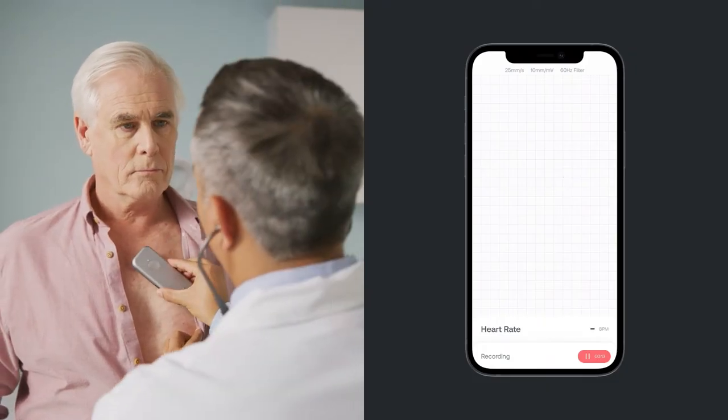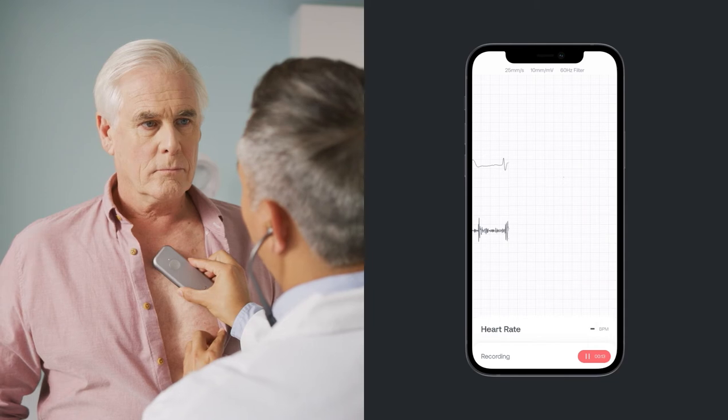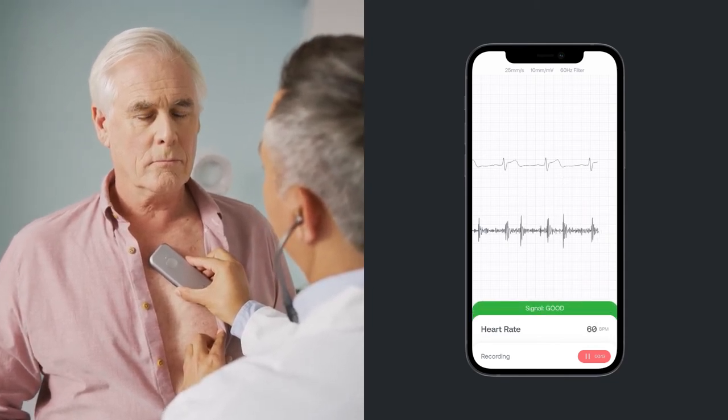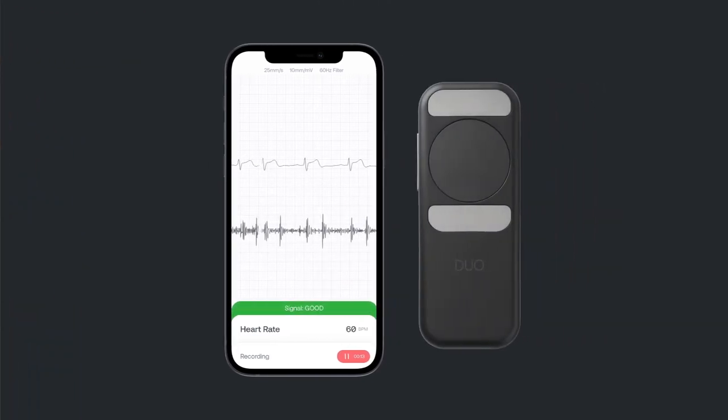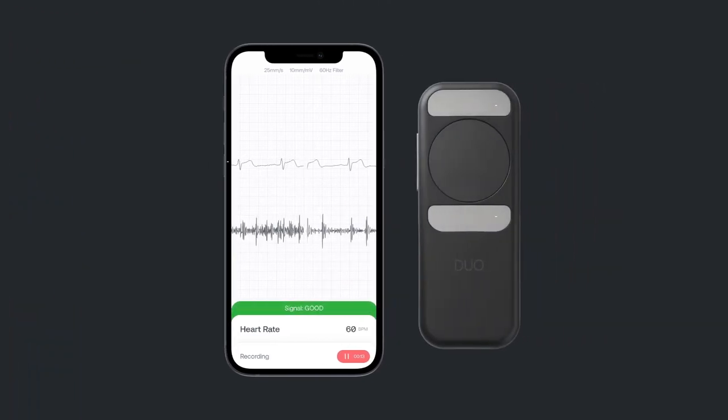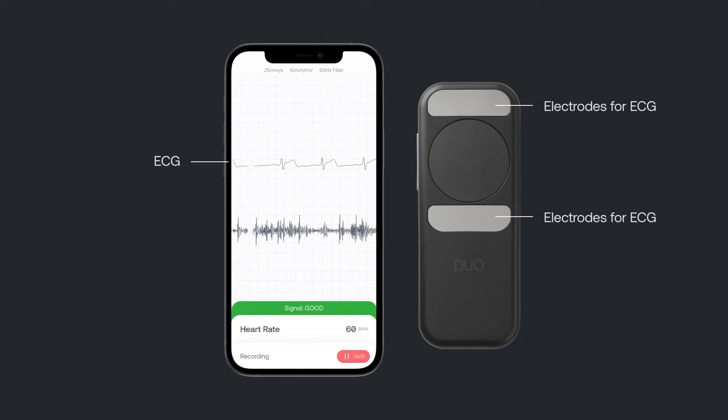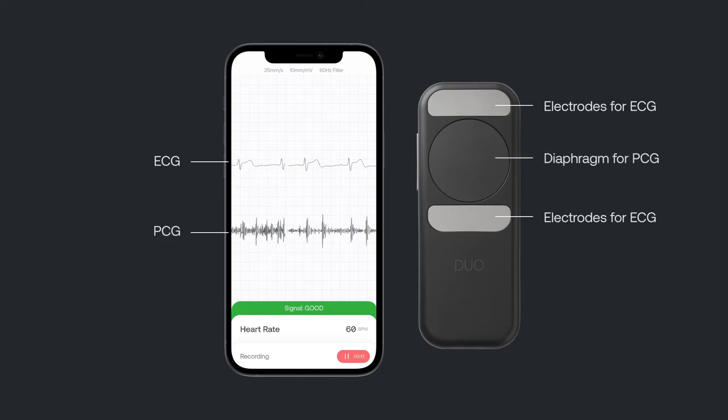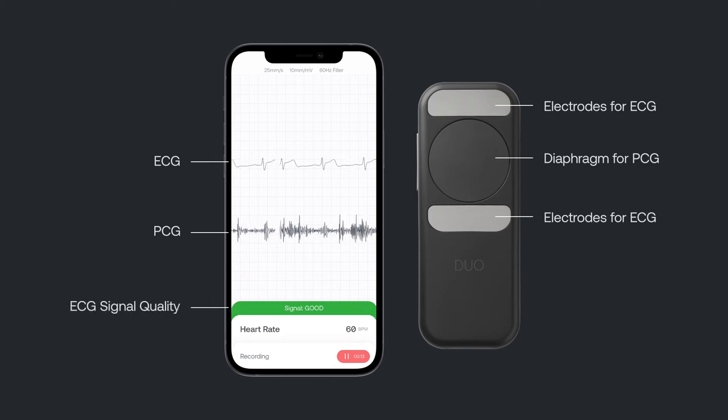Place the Duo on your patient's chest and waveforms will begin to appear on the app. You'll see the ECG rhythm at the top of the screen and the visualized stethoscope sounds, known as phonocardiogram, below. The screen also features an ECG signal quality meter and heart rate.